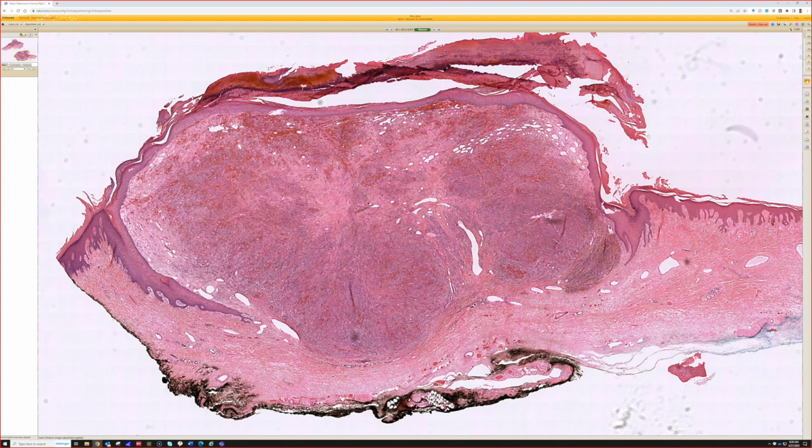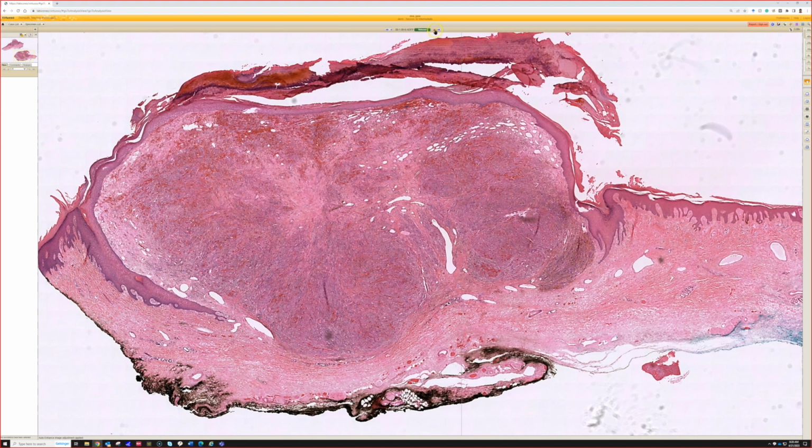And also it doesn't usually metastasize. There are forms that can be more progressive and get into the organs and stuff. But most often when I see this, it's a disease that people die with rather than die from, if that makes sense. So again, it's very, very different from angiosarcoma, which is managed totally differently. So really important to understand that and to make that distinction between the two.